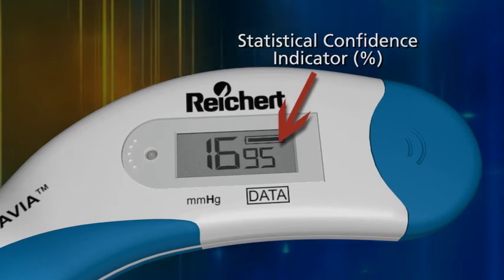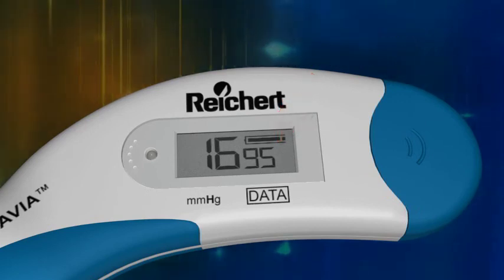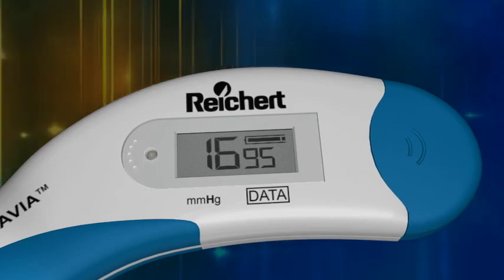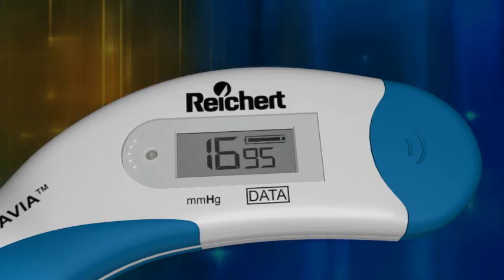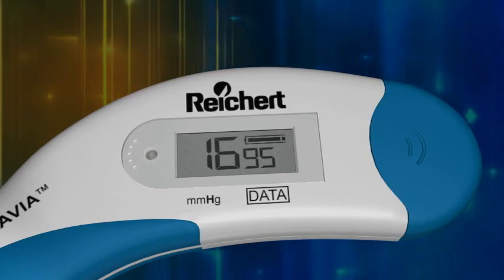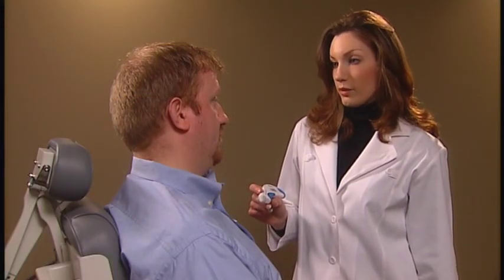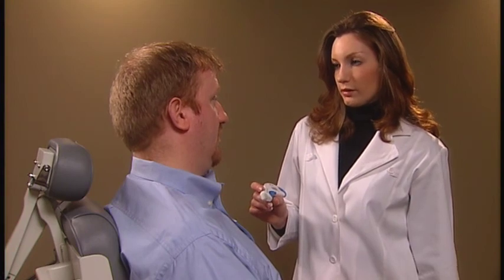In this example, the average of the readings is 16 millimeters of mercury with a statistical confidence indicator of 95%, representing a very reliable measurement. If you are satisfied with the results, the test is complete.